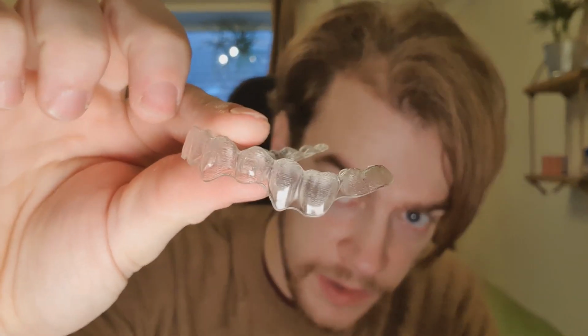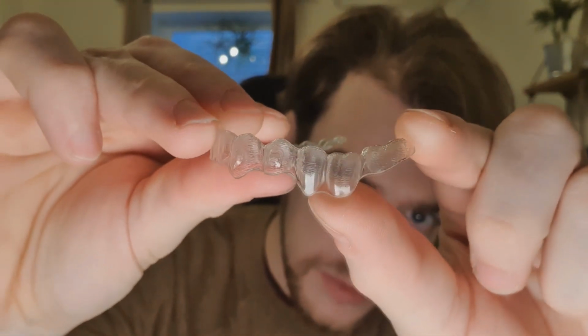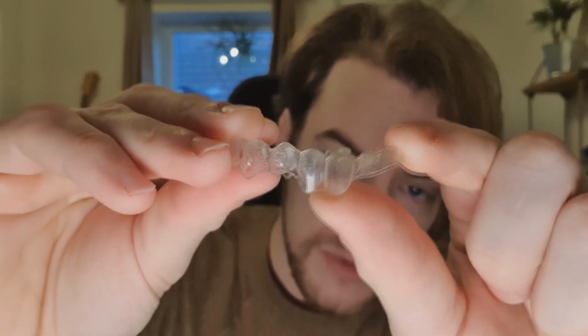hopefully you can see what that looks like at the back. This was not really sitting on my back teeth like the others did. There was a noticeable gap there, and it would kind of rattle on my teeth. And what happens is your tongue notices that difference. I could feel the tray was loose with my tongue, and I was catching on it. I thought, oh my god, this is annoying. For the first time it was annoying.